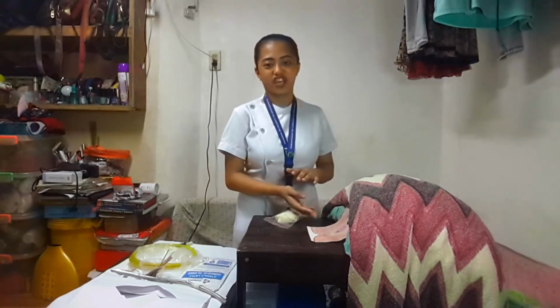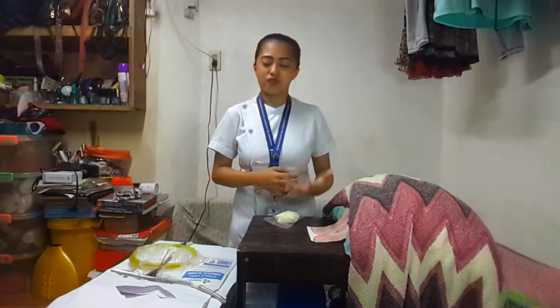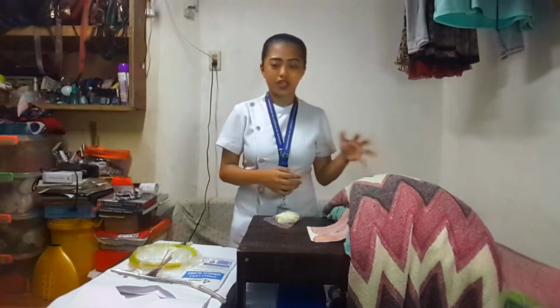After that, we also need to provide privacy to the patient while doing the whole procedure, especially now because we're exposing her genitals. It is really important to provide privacy in order for her to be comfortable while doing the procedure. After doing all of that, we proceed to the implementation proper.